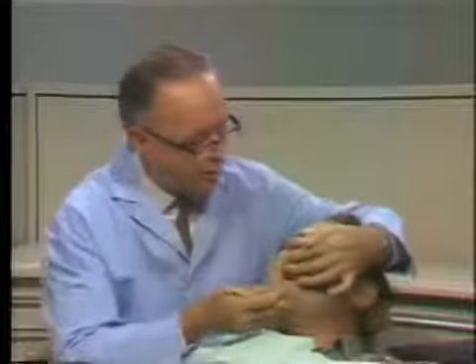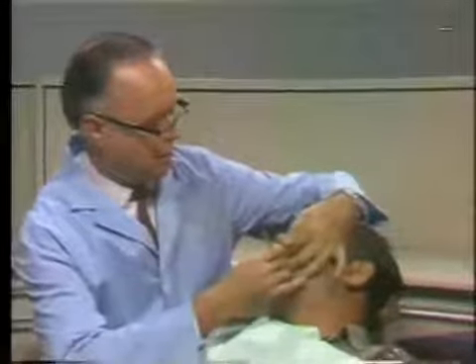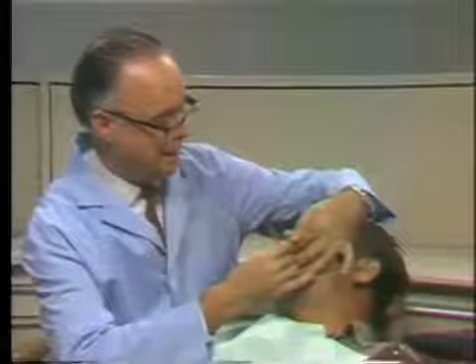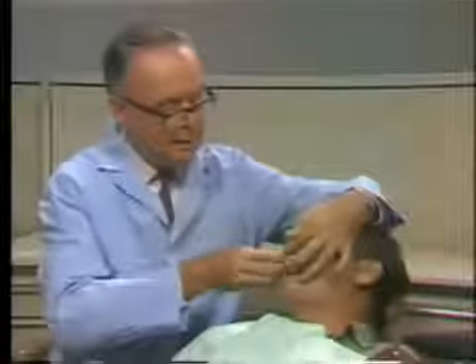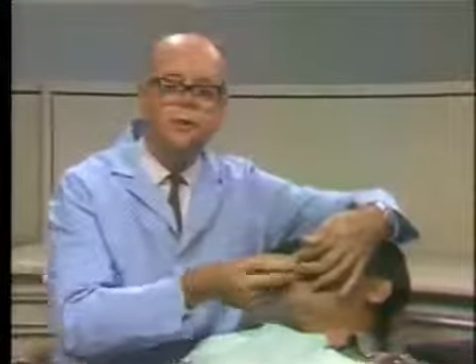That's the first line drawn on the proximal of the cuspid tooth there. We'll take this out now and draw the second line, which will be just lingual to that. And then pop our facing back again and take a look at that second line, which you cannot see because of the relationship of the teeth, and that means that it's just nicely hidden from view there. So we're now ready to go ahead and do the preparations on the pin ledges, which is not something that we're going to cover today, so we'll stop at this particular point.